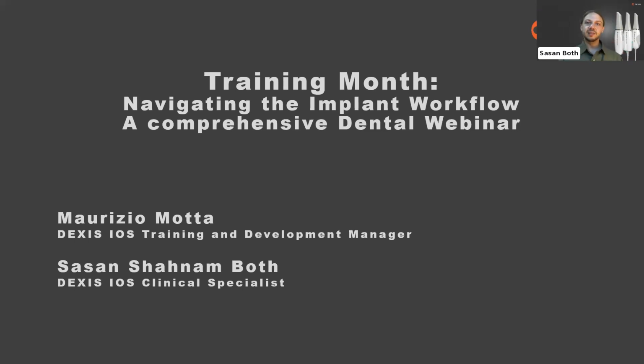So those that did set up the checkpoint, you can actually get information from us and we can contact you. Again, you'll receive a recording of this session today. What we'll be focusing on today specifically is the implant workflow. And this will be our comprehensive webinar to show you that with Maurizio and myself. I'll speak on some of the theoretical things initially, but we'll quickly dive into the practical components where Maurizio will really dive deep in the software, open up some cases, and go into detail in terms of the process.